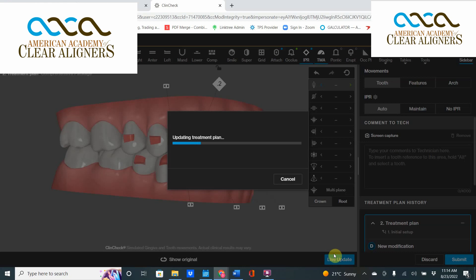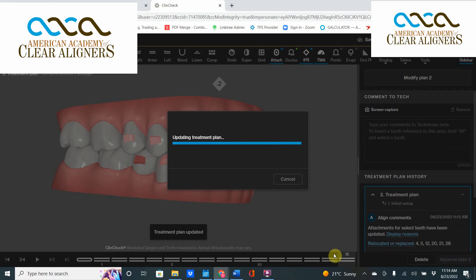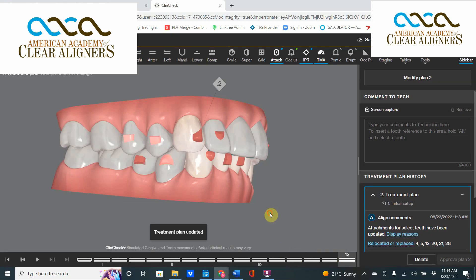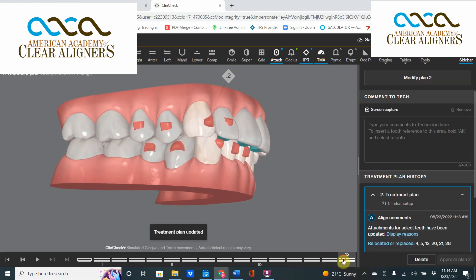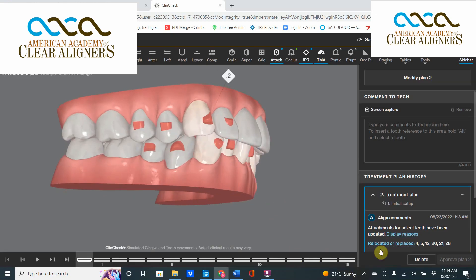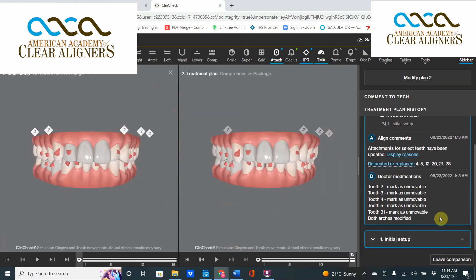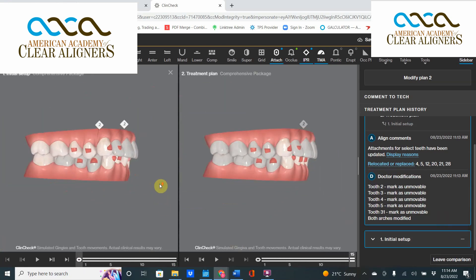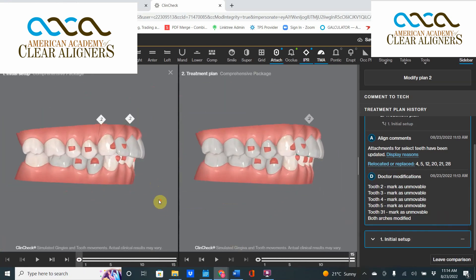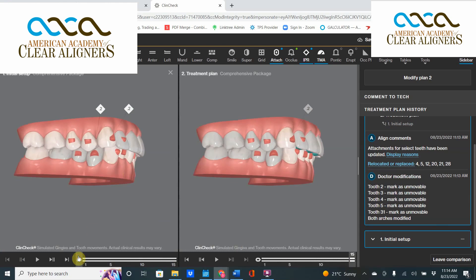The ClinCheck will be simplified without those movements, and let's see if those premolars now retain their excellent initial position. It usually takes about 90 seconds or so. Now let's take a look — the treatment plan has been updated. Those teeth stay as if they remained in their nice occlusion and the case proceeds as is. If you wanted to compare it to the original one, you can see the same amount of aligners.